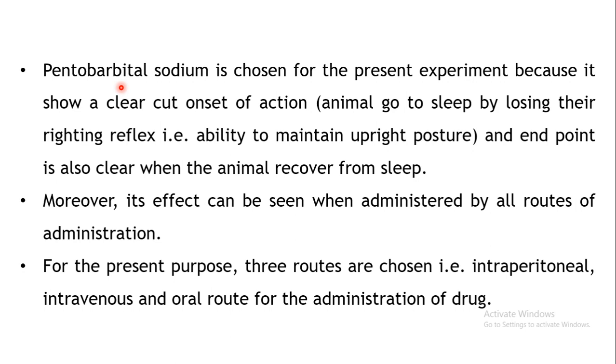Why we have chosen this drug is because it shows a clear-cut onset of action. That is, when the animal goes to sleep, it loses its righting reflex. The righting reflex is the one seen when you place the animal, a mouse or a rat, on its back.